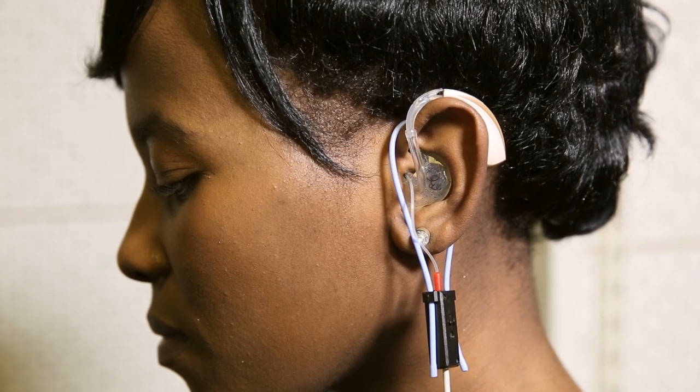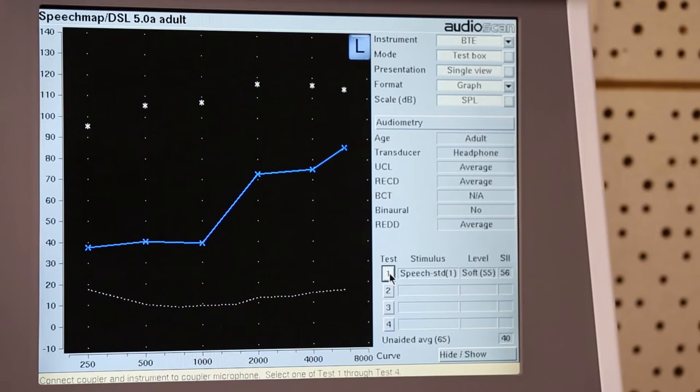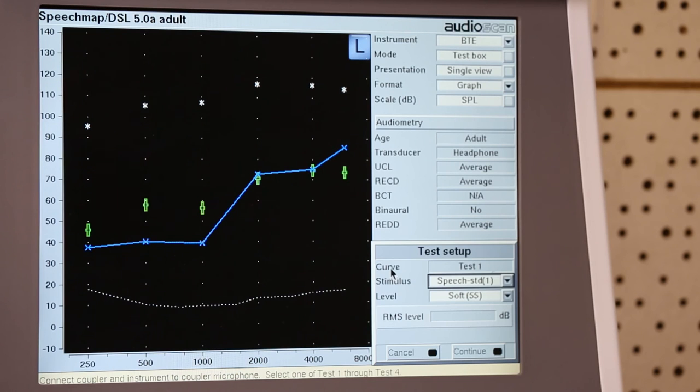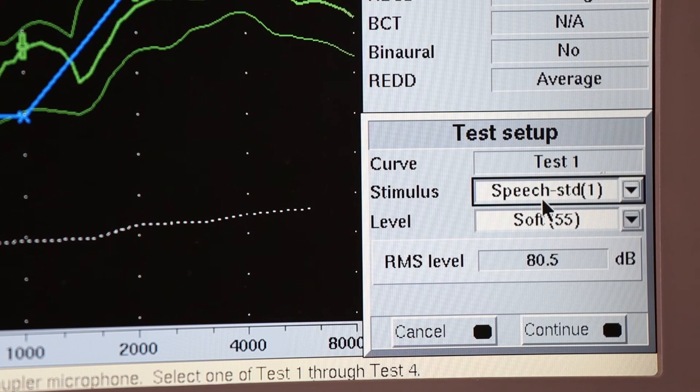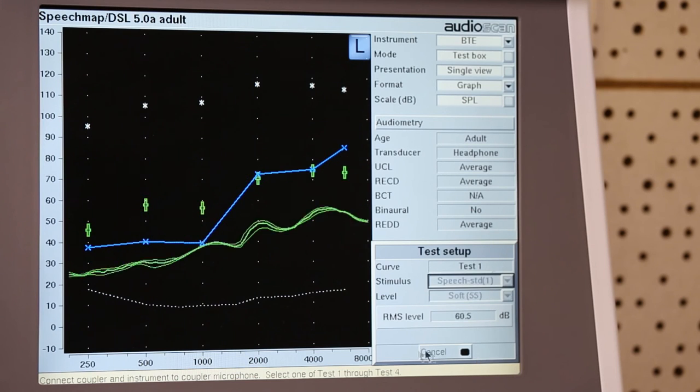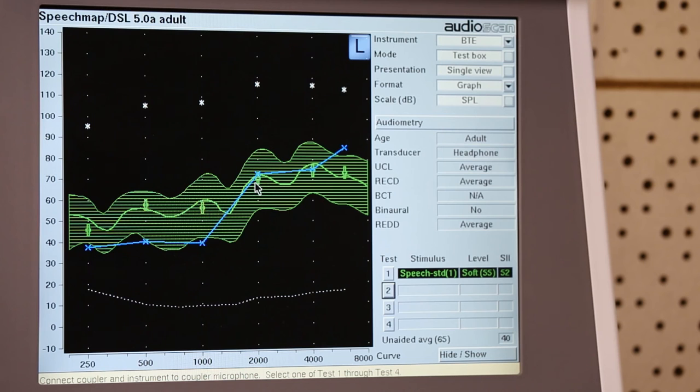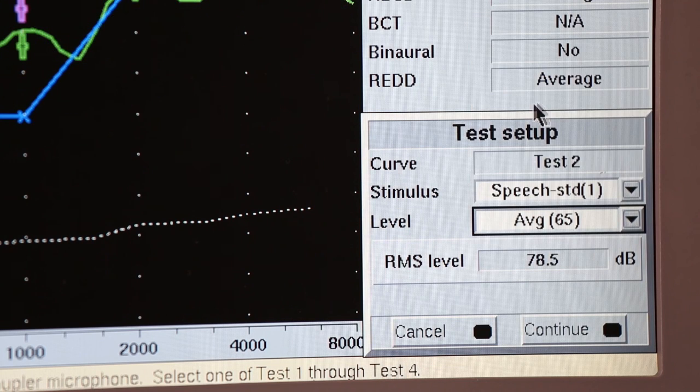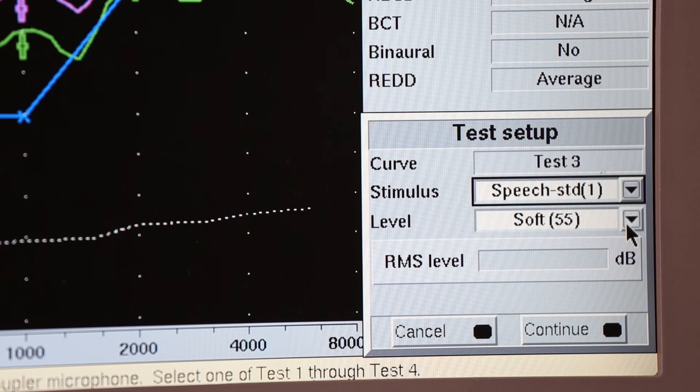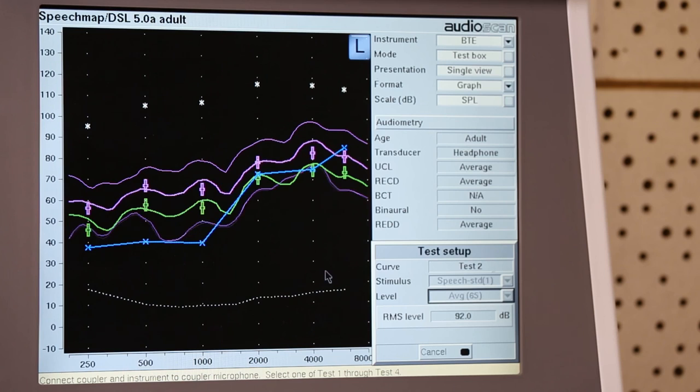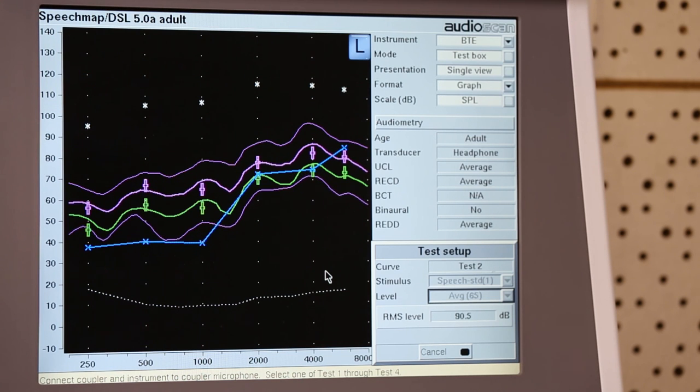The client should now be facing the speaker for speech mapping. You will now press one and then press continue once you have checked that it is presenting the correct stimulus at the correct dB level. You will now see the target and you are wanting this middle line to dissect the target across the frequencies. You can repeat the test at each of the dB levels, usually at 55, 65, and 75 dB, and manipulate the gain on the hearing aid software to ensure you get a good fit to target.